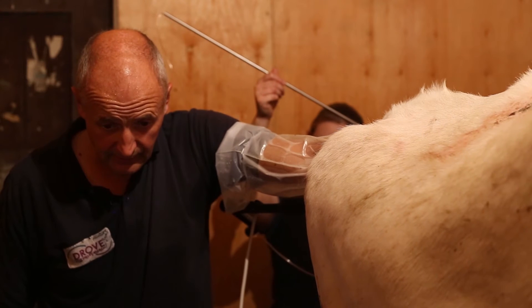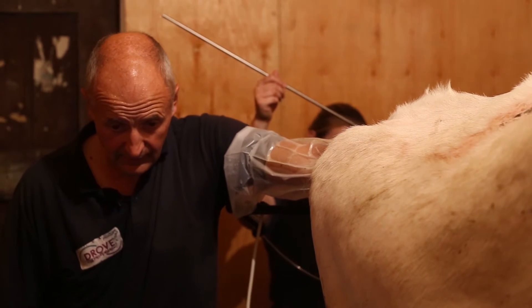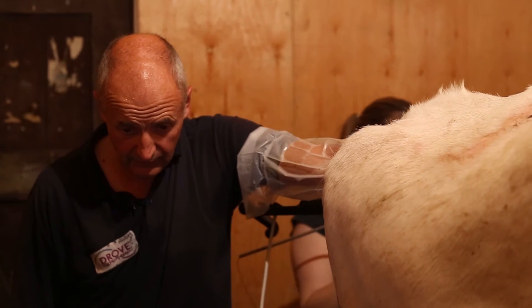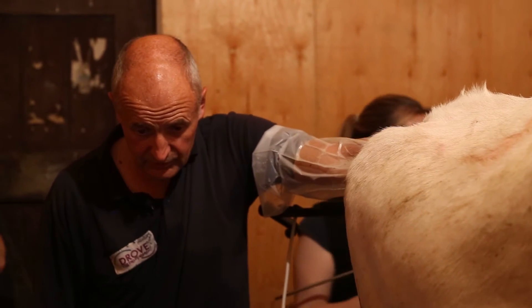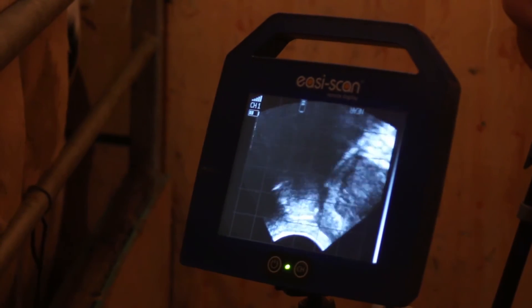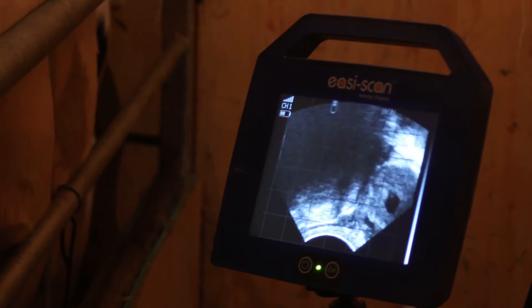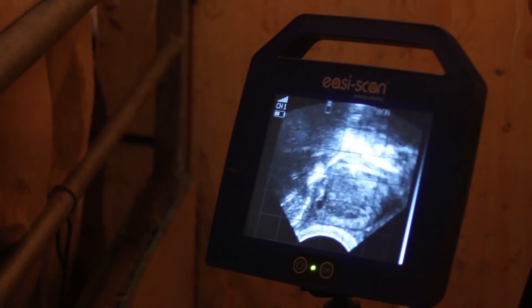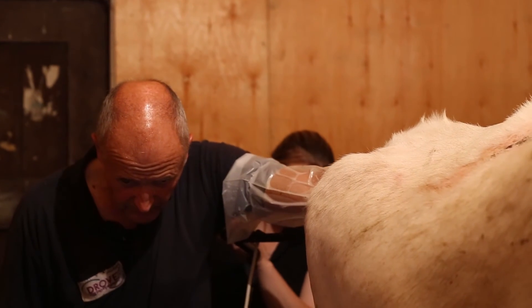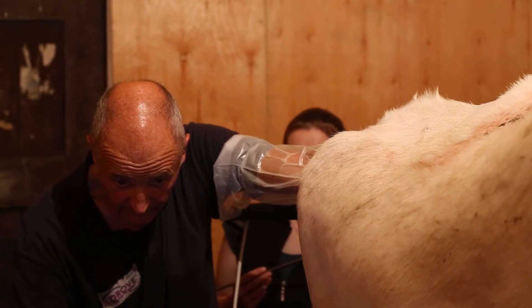Not many left now — just might have one more go. One of these little fellas left there. Going to rotate the ovary around to get the follicle close to where the needle will emerge. Just trying to find the little fella. That's the big fella that's gone now.